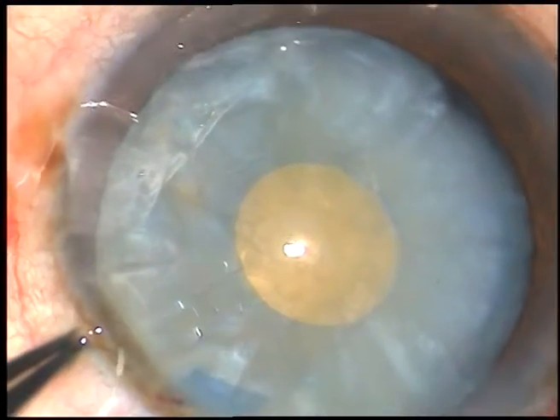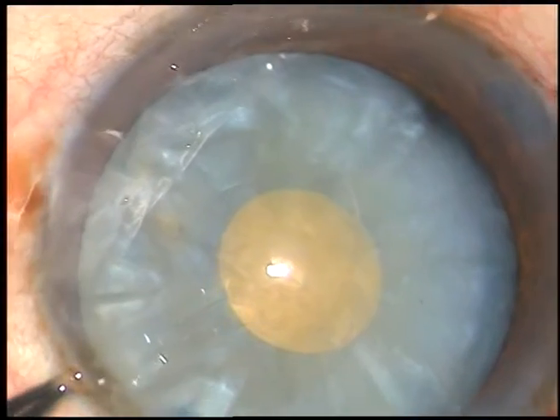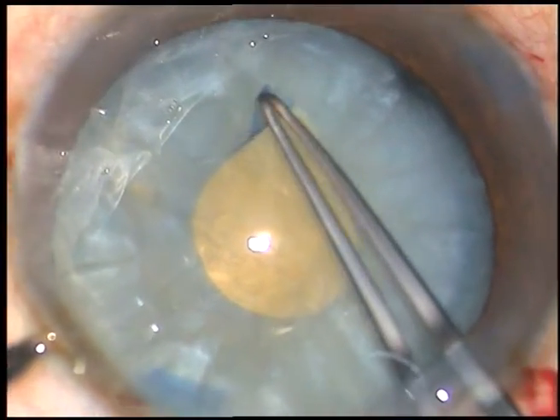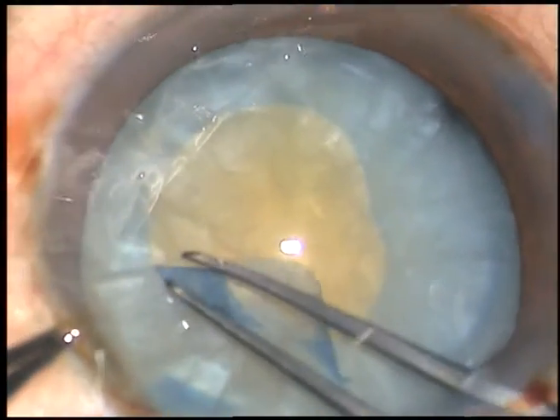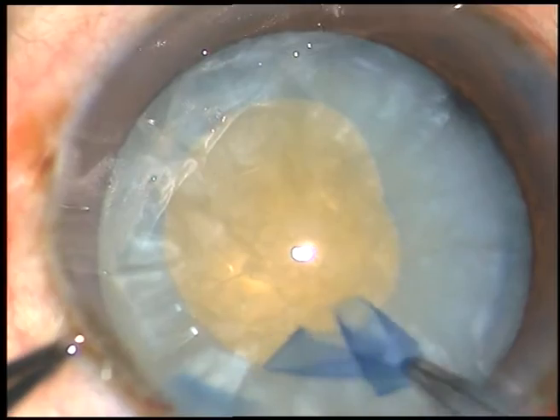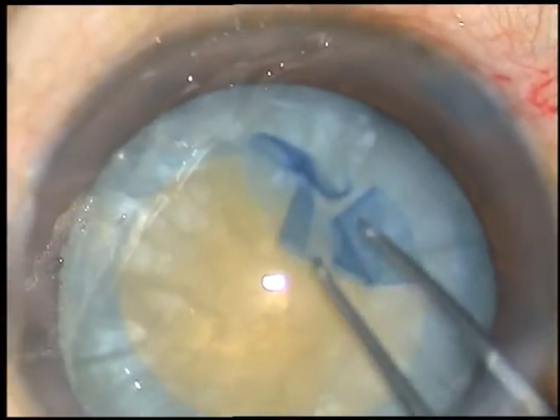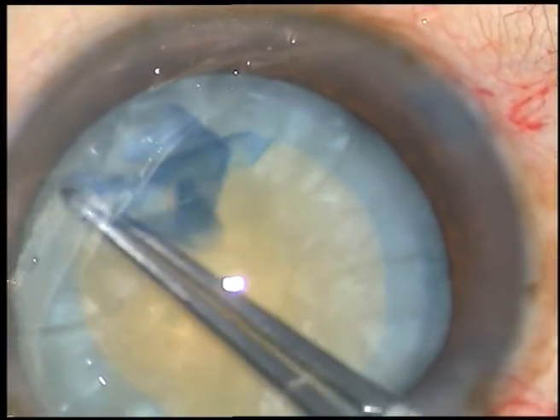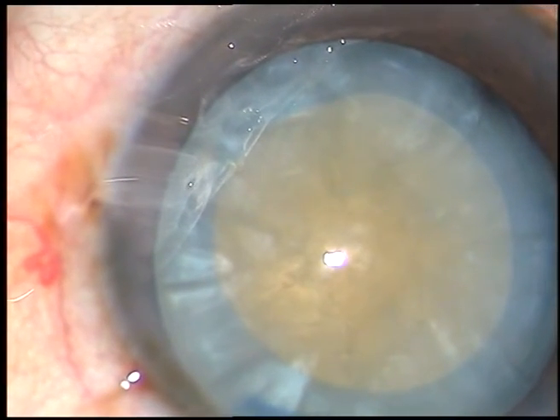Now, make a small cut at the margin of this rhexis. Hold this tag with the Utrata and enlarge the rhexis to an optimum-sized one. At this time, see there is no tendency of the capsule to run to the periphery, and we can do a nice rhexis like this.